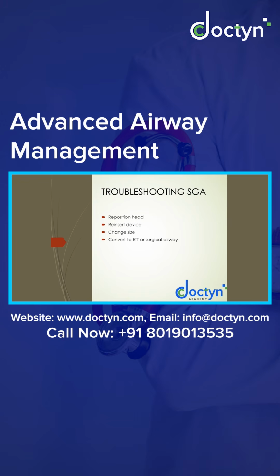So how do you troubleshoot all this? First you reposition the head, you check that the head is not in a different position. Even then, if it is not improving the saturation or the ventilation is not being delivered adequately, you reinsert the device. You try to remove the device and reinsert it, readjust its position. You change the size, upsize or downsize the supraglottic airway device.